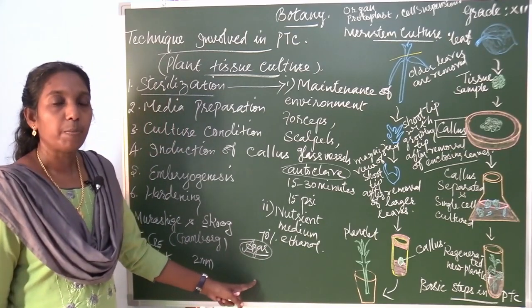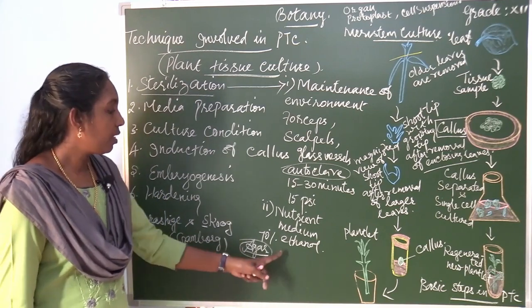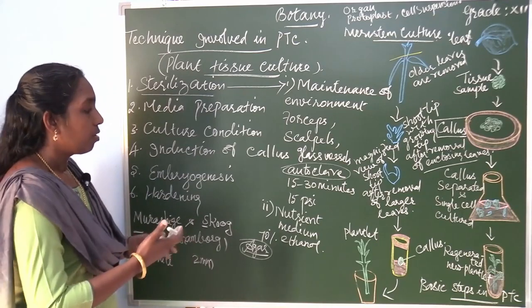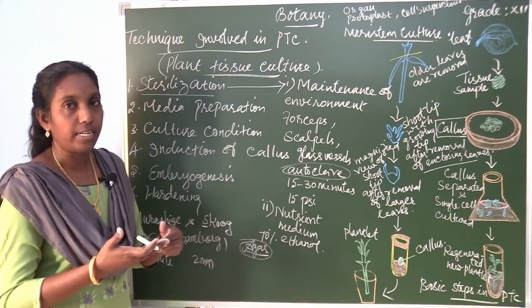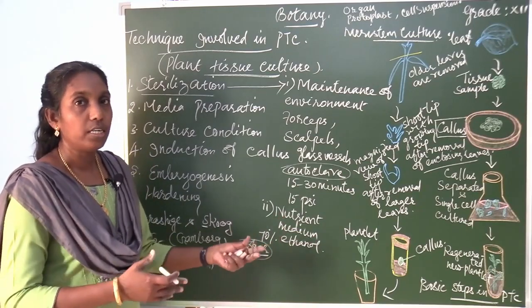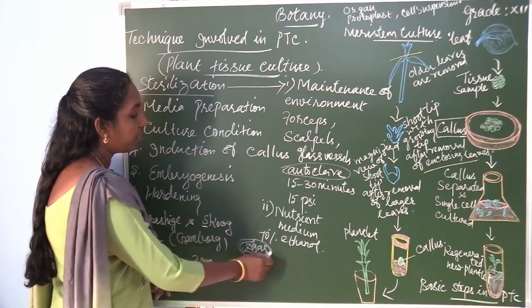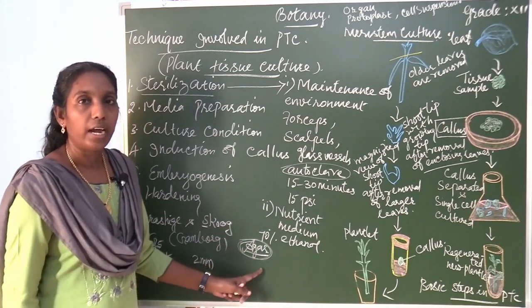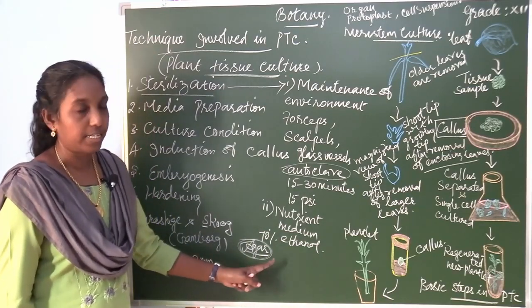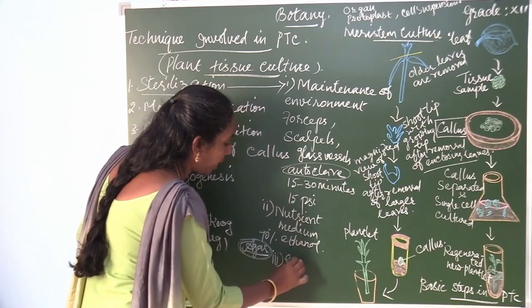Agar is prepared from a marine alga. So this is used for solidification. Whether liquid or semi-solid, it can be solidified with agar, so it is also added to the medium. So the nutrient medium can be sterilized. And then the sterilization of the explant.